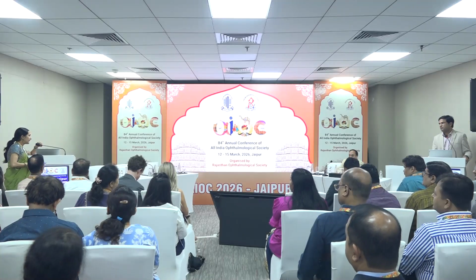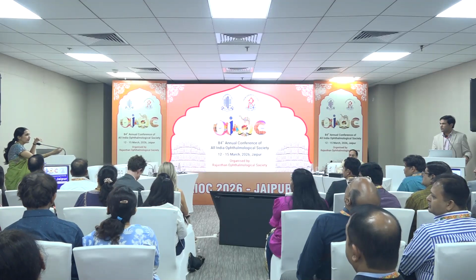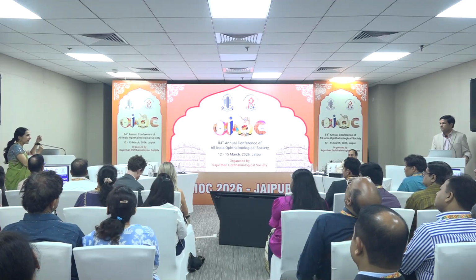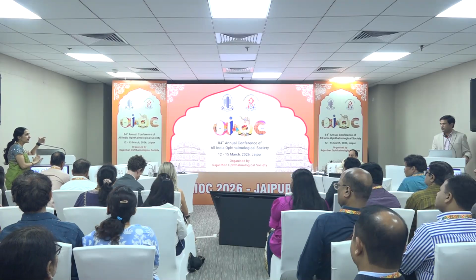And one last thing I would like to say is in these thick lenses, be very careful of your incision size when implanting. If you are normally doing a 2.2, if my IOL is 25 diopters or above, I will do a 2.4 incision. It's a thick lens, particularly hydrophobic lenses. So I would enlarge it a shade more and make my implantation more smooth.